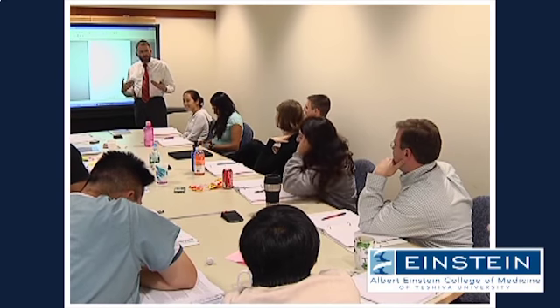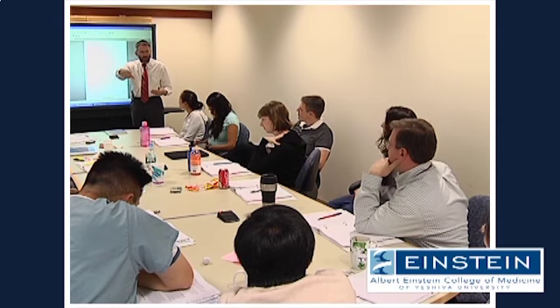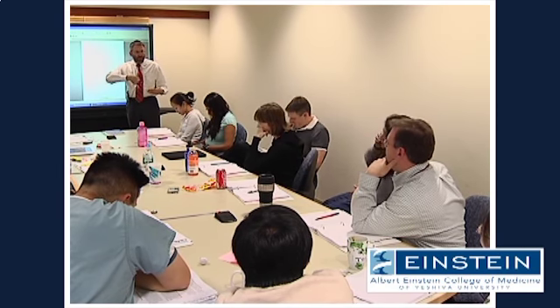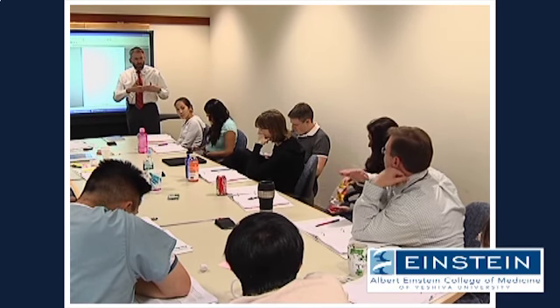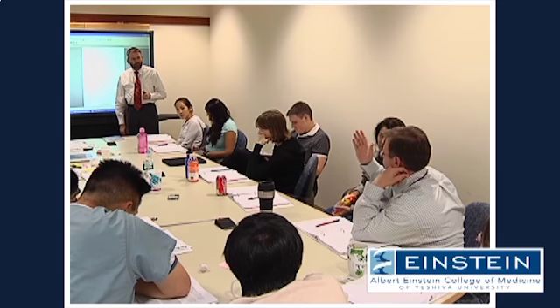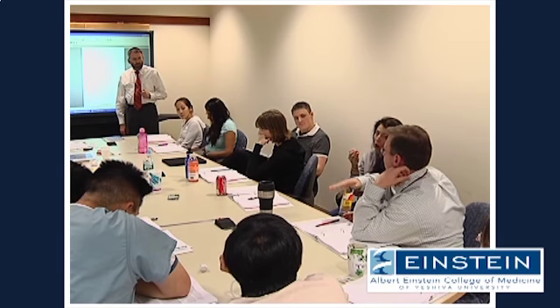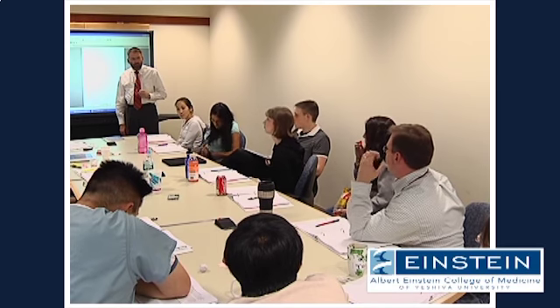If you excite a coronal slice, that's using a gradient magnetic field that goes anterior to posterior relative to the patient for slice selection. Does the direction of the transverse magnetization within the slice have to do with the angle of the slice at all? No, it doesn't matter. No. Okay, that's what I'm getting at, I guess.